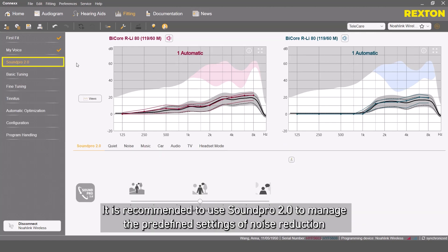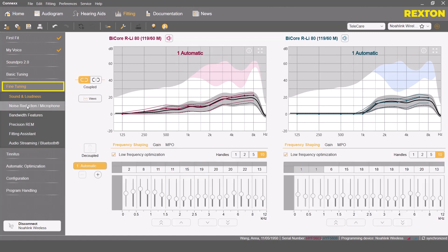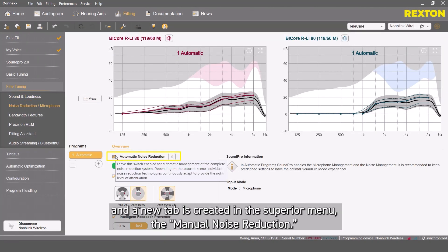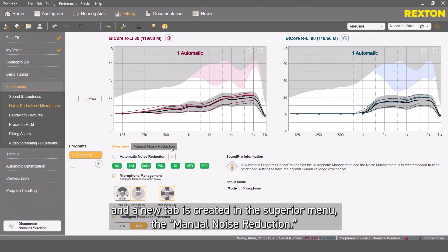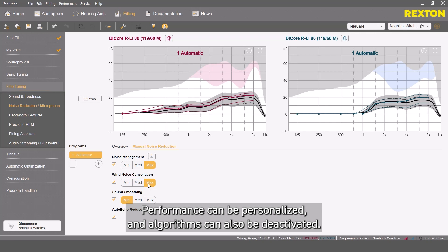It is recommended to use SoundPro 2.0 to manage the predefined settings of noise reduction and microphone settings within the automatic program. The default settings can be changed by clicking here, and a new tab is created in the superior menu — the manual noise reduction. All available noise reduction algorithms will sit here. Performance can be personalized and algorithms can also be deactivated.